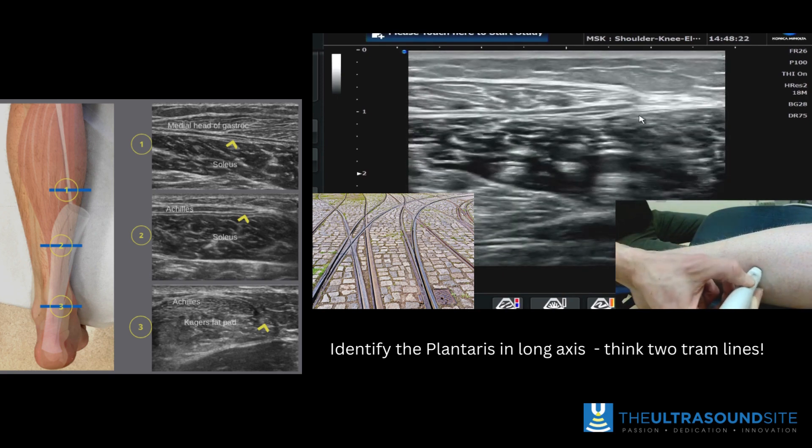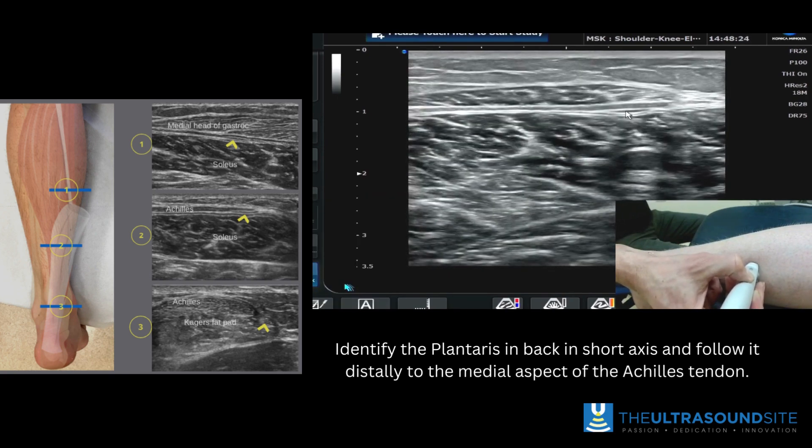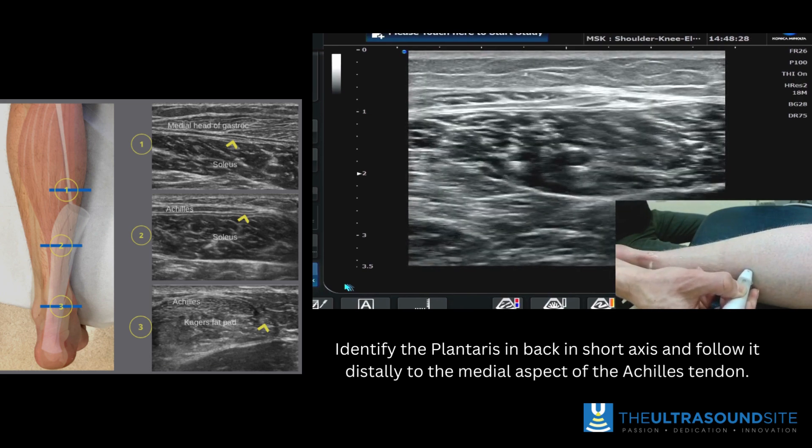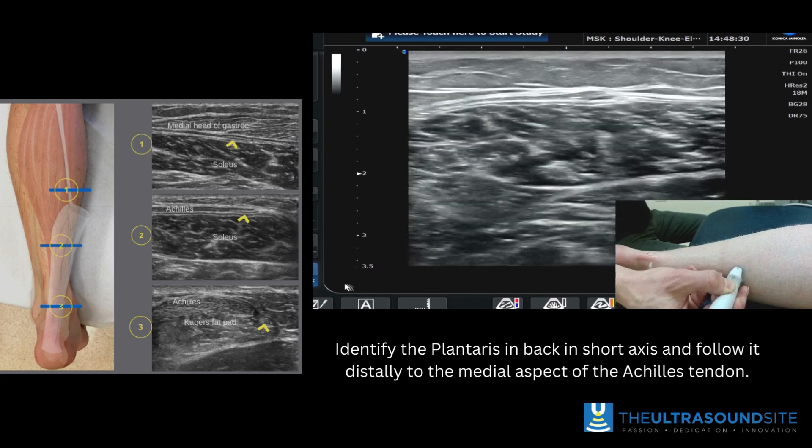If you come back into short axis, you'll see the plantaris sitting deep to the aponeurosis, and it sits just on the medial aspect.